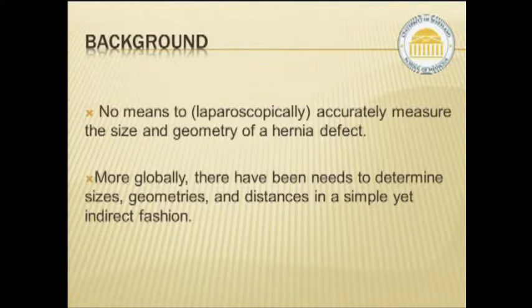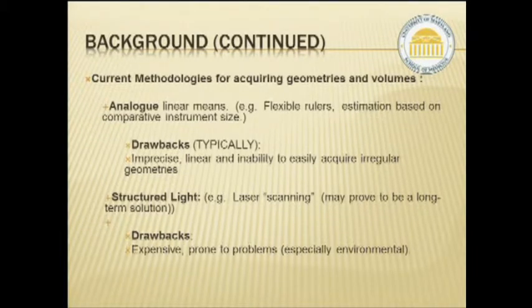So we have no disclosures relevant to this to show. Essentially, I won't get into herniorrhaphy too much here. It's not really the aim of this, but in attempting to measure hernia defect, we were basically asking how we could measure hernia defects in a more accurate fashion than in the past. We also recognize that measurement of the hernia defect is key to a successful hernia repair. And so we wanted to do it from an indirect fashion.